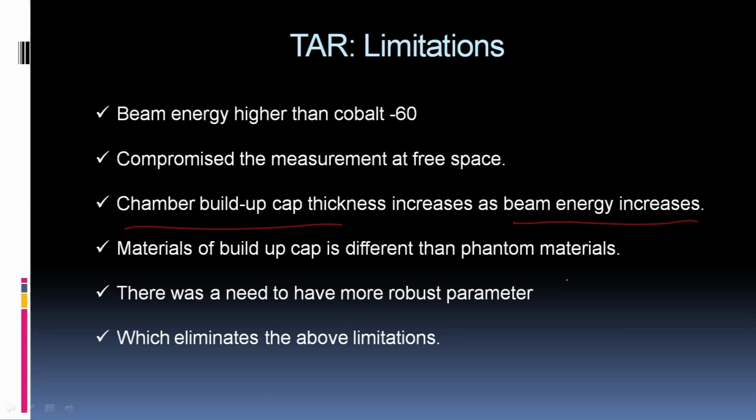The second problem is that the material of the build-up cap is different from the phantom material. For accurate dose calculation, there is a need for more robust parameters which eliminate the above limitations, meaning the compromised measurements in free space and the distance dependence on the source to surface distance.